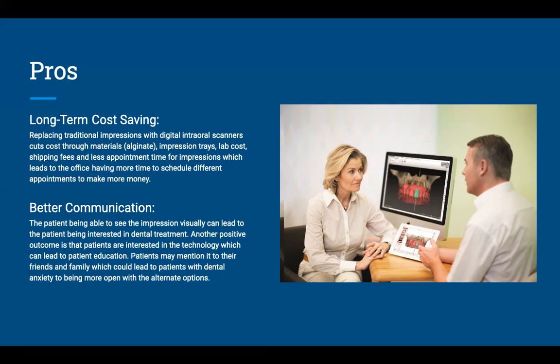Some other advantages include better communication. This is very important, and it also reflects the field of dental hygiene, because the patient is able to see the impression visually. With this, they are more inclined to be involved with their dental treatment. It's a positive outcome because this will establish that conversation of patient education.